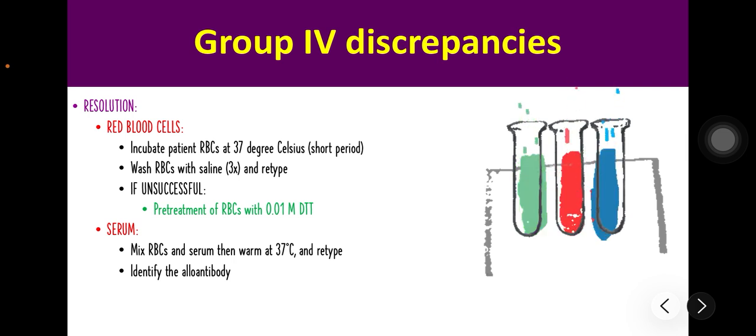We also have antibody identification. If a non-ABO antibody is suspected, a full antibody panel is performed to identify it. The reverse typing is then repeated using reagent cells that lack that specific antigen. You can also have chemical treatment. Reagents like your DTT can be used to break down certain antibody structures to stop them from causing spontaneous clumping.